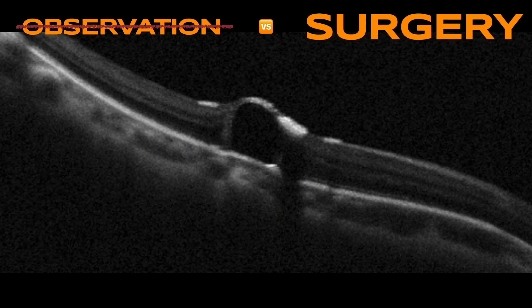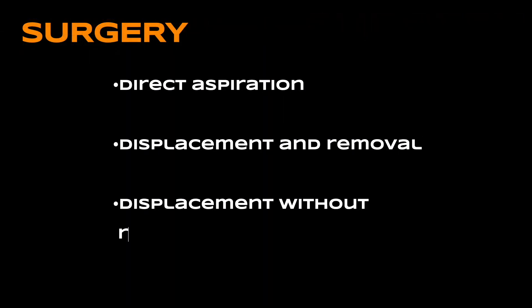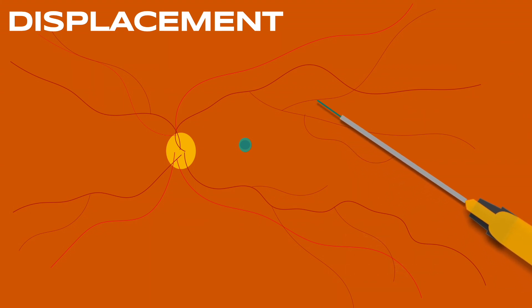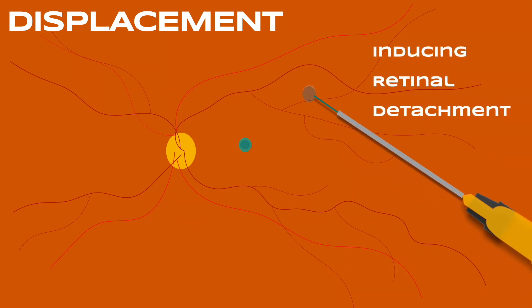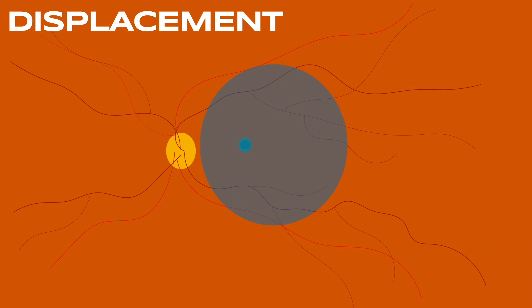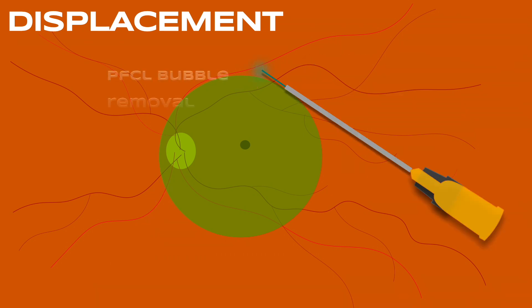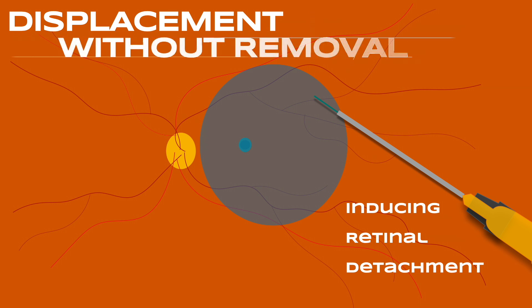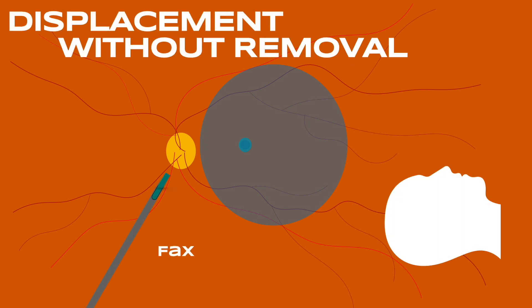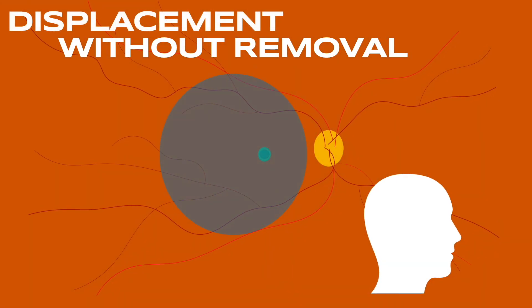A new surgery was indicated for the removal of the subfoveal perfluorocarbon four weeks after the first procedure. Various techniques have been described for this approach. In one of them, it is possible to induce macular retinal detachment by injecting BSS with a 38-gauge cannula, displacing the perfluorocarbon bubble inferiorly. Some surgeons place perfluorocarbon on the macula to push the bubble to the periphery and perform a retinotomy near the vascular arcades to aspirate the bubble intraoperatively. Other surgeons prefer to perform a fluid-air exchange and leave the patient in an elevated head position of about 45 degrees in the early postoperative days, allowing the retina to reattach in the macular region and the subretinal perfluorocarbon bubble to be retained outside the central vision.